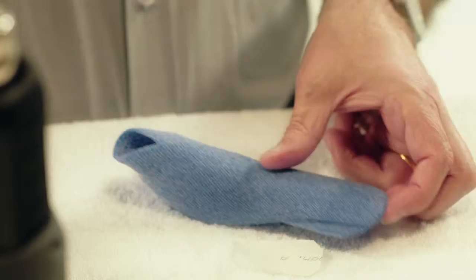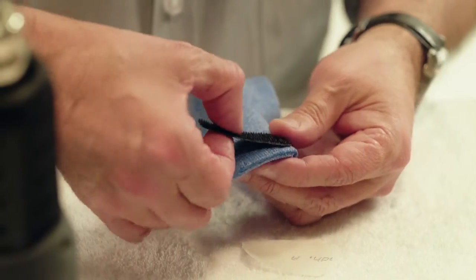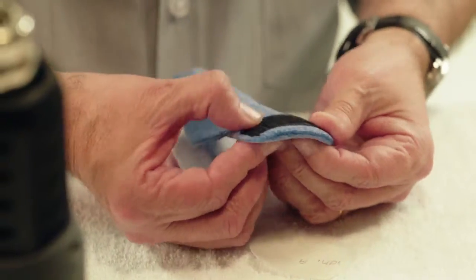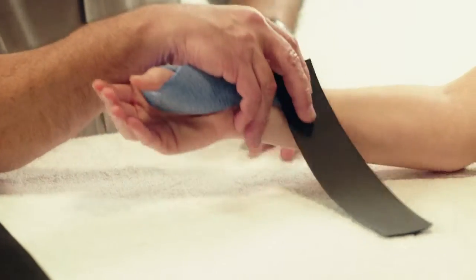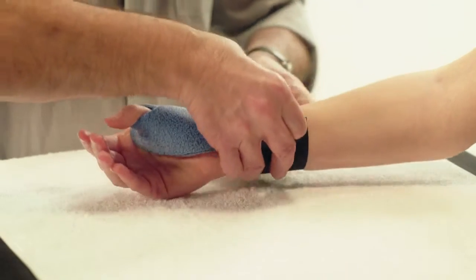Heat the self-adhesive glue of the Velcro hook and stick the Velcro hook onto the orthosis. Cut a wide strip of Velcro loop and strap the orthosis onto the forearm.